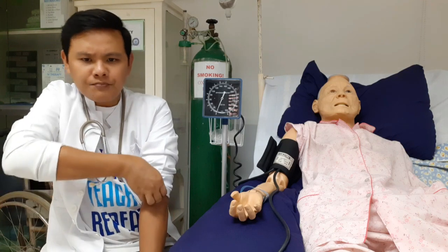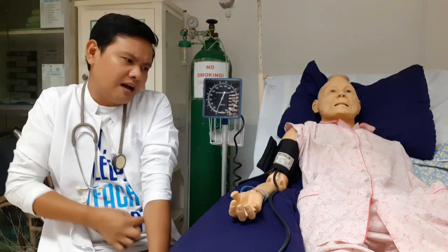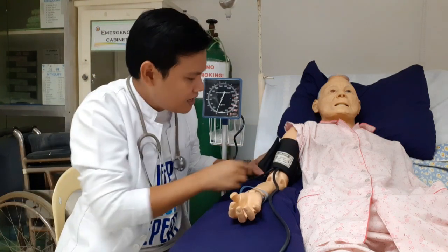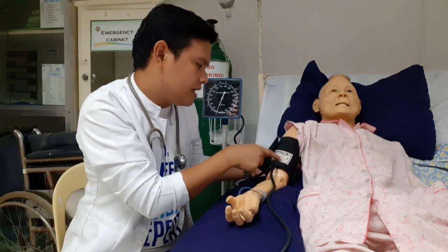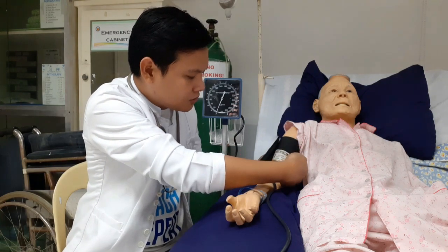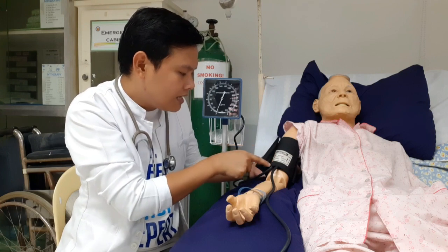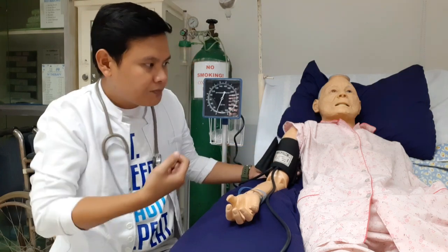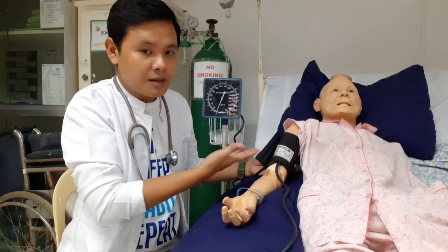Okay, what else? You have to apply the center of the bladder directly over the artery. As you can see here, madali naman malaman yun. Ayan, artery, right arm, dapat andito yung brachial. Now, if you're going to use the left arm, ito yung arrow, kailangan nakalocate dun sa may brachial artery. So that's how you put the BP cuff.